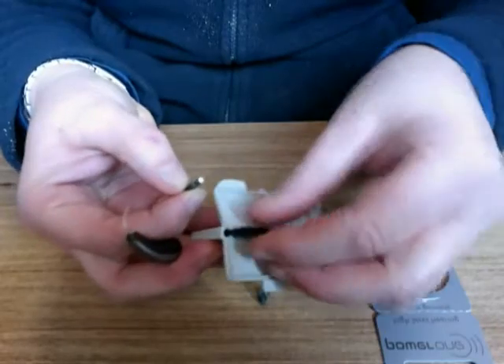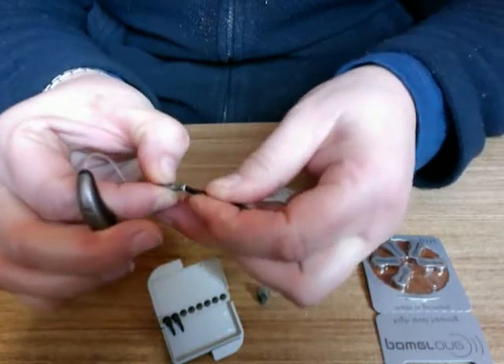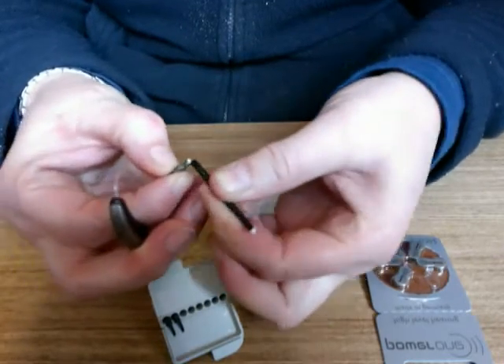Taking a new filter, we use the other end to remove the current filter and then place the new filter within.